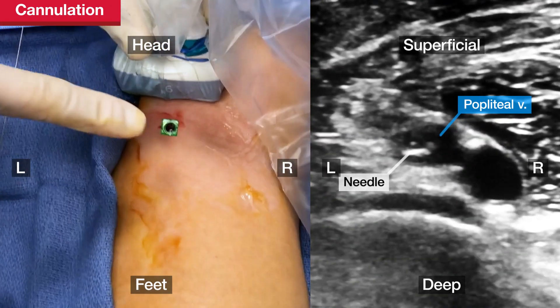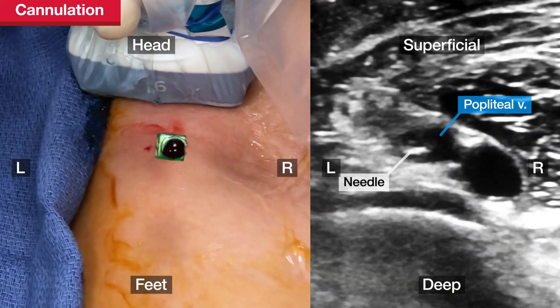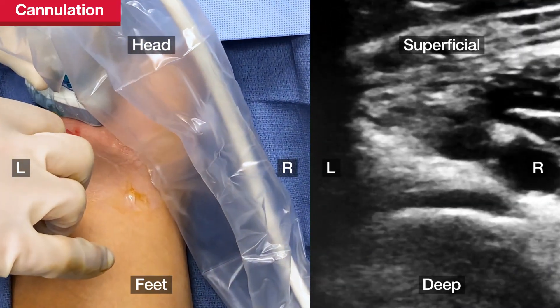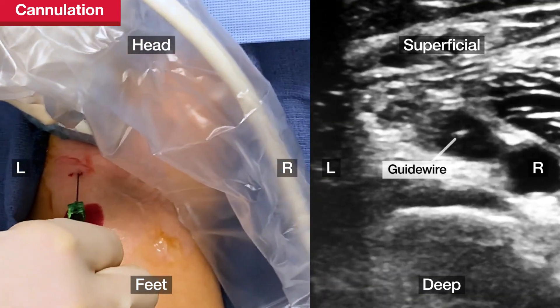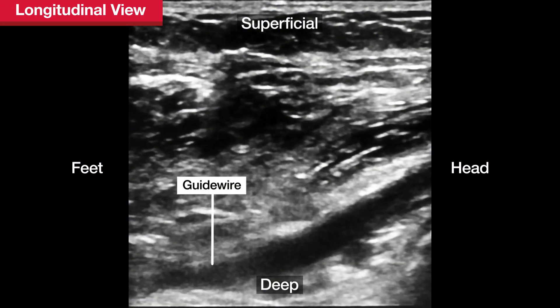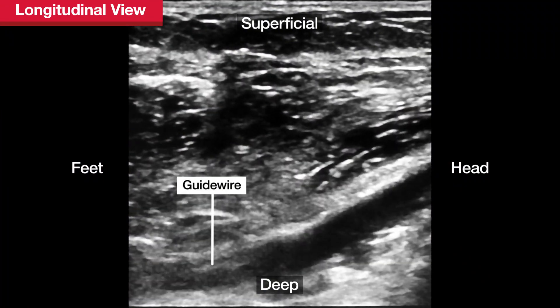Blood will return from the micropuncture needle when it is in the vessel. Introduce the guide wire through the needle. Confirm that the guide wire is in correct position by rotating the transducer and viewing the vessel in the longitudinal orientation.